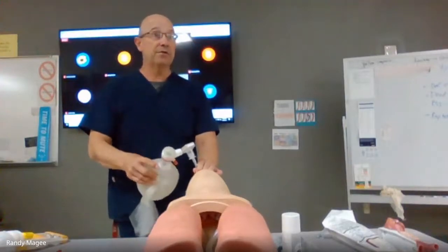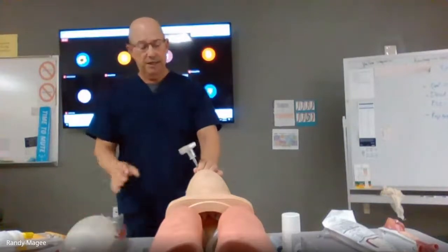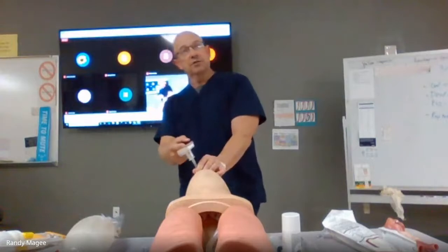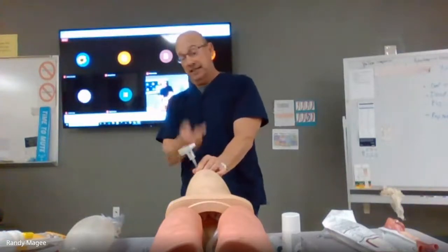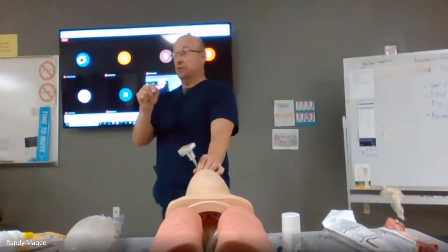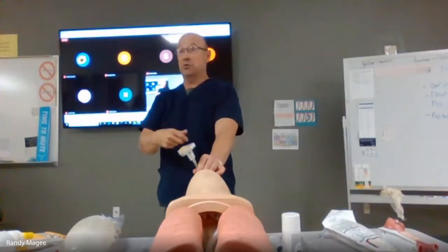All these hubs are sort of universal. I have good color change, okay? So you have to confirm the tube in 3 different ways. One way is the color change, okay? The second way is that I saw that it passed through the vocal cords, okay? So I'm going to document the color change and that it passed through the cords.